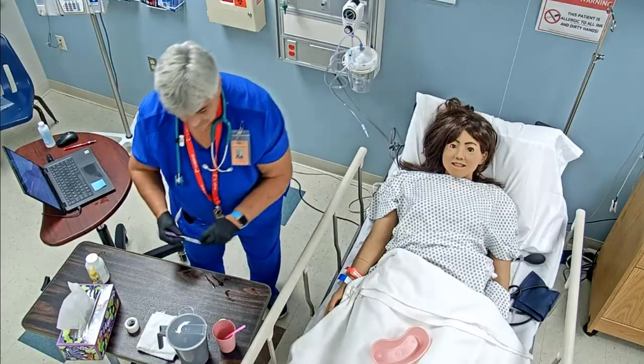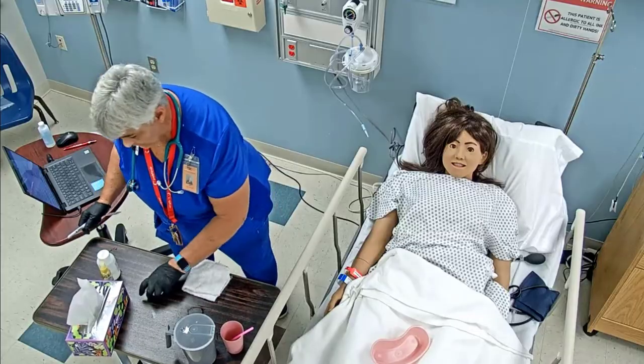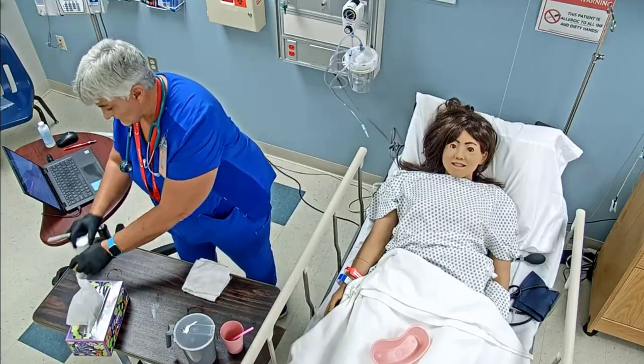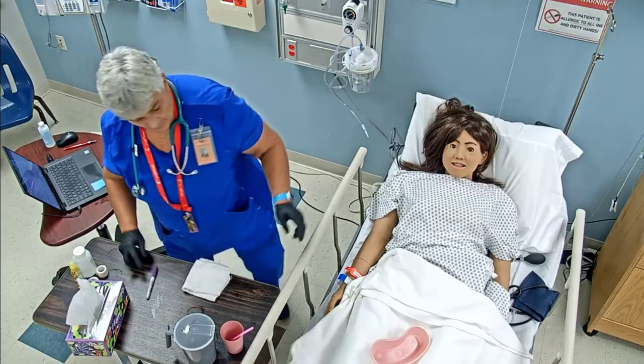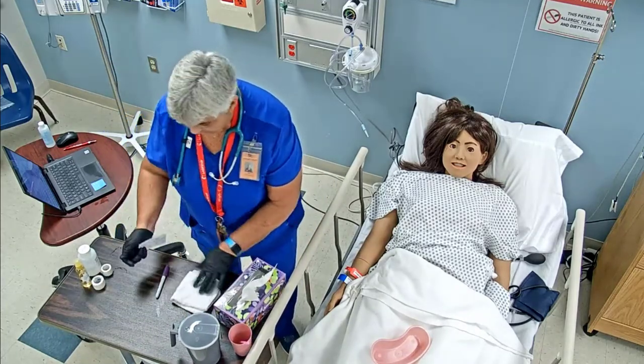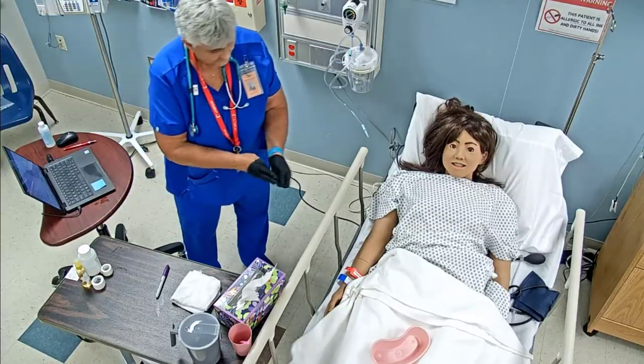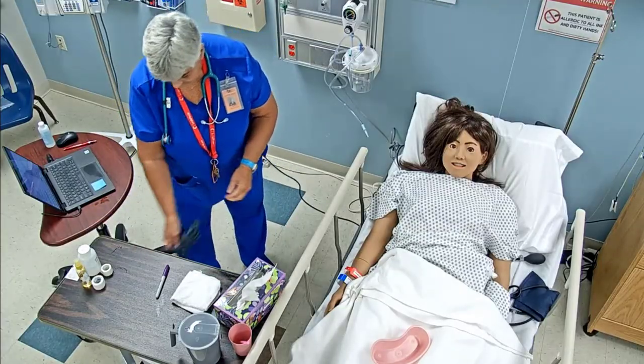So we don't need that. That's mine, and so we'll clean that. Just make sure you have a clean, dry spot. I put this on the back side of the table, and I'm going to make sure this is close so that you can get to it. Here's some extra tissues if you need it. And so glove to glove, skin to skin.